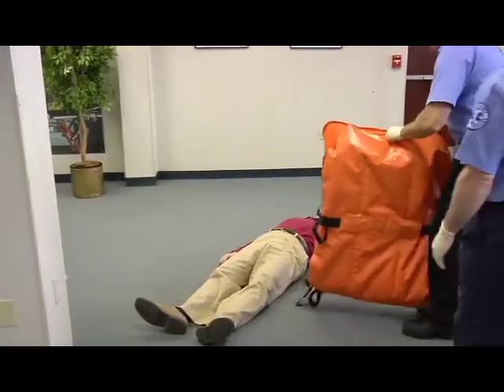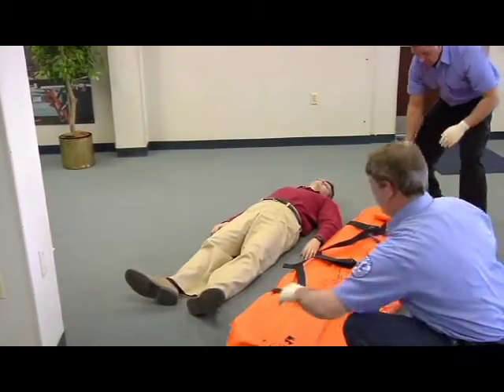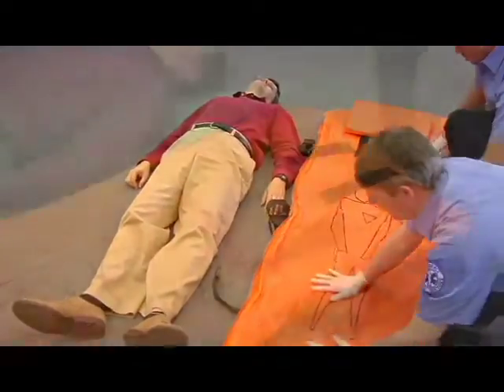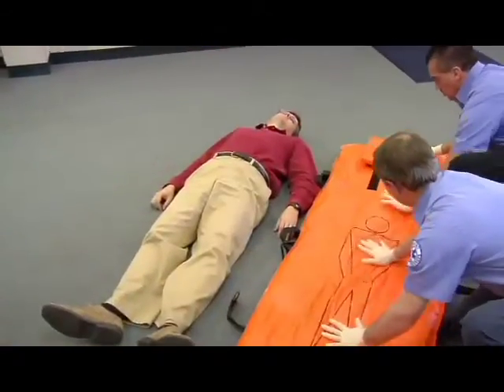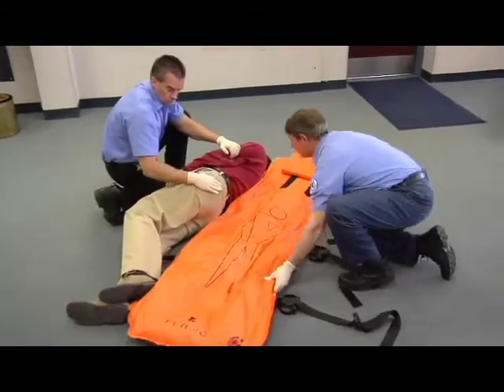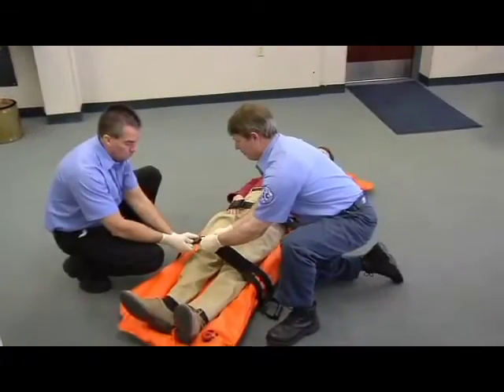To apply the mattress, unfold the mattress and lay it next to the patient with the air valve, pillow, and restraints facing up. Open the restraints and lay them to the sides of the mattress. Adjust or remove the pillow as needed. Smooth the mattress to a uniform thickness. Transfer the patient onto the mattress using local protocols. Center the patient on the mattress as much as possible and fasten the restraints.